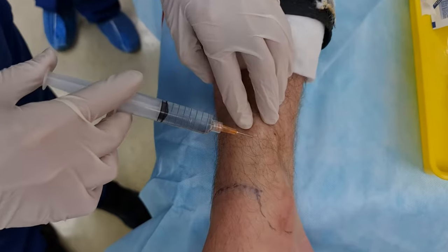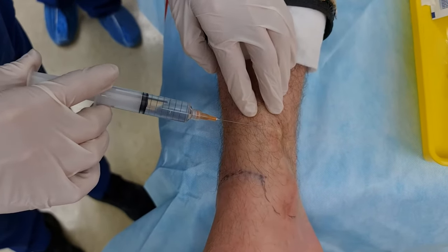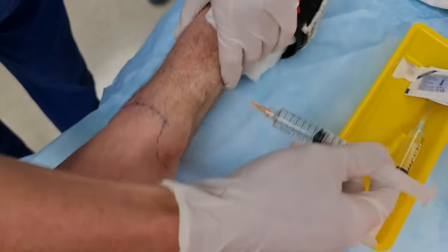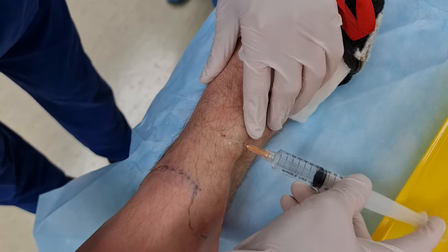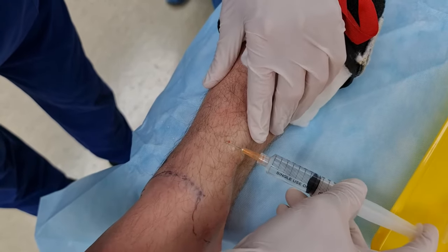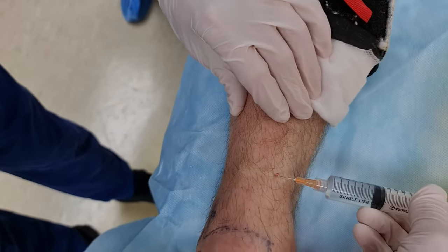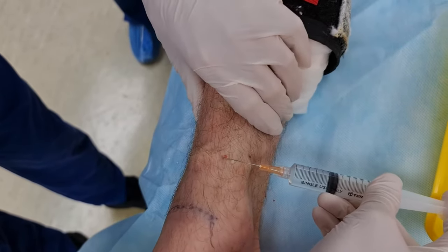You can see you'll draw up a bleb in the superficial layers of the skin. Then we're just going to work from the saphenous across to get your superficial peroneals as well. Same technique — you can see the slight superficial band there, so you're going to avoid that. Same caterpillar technique, and you'll see your bleb drawn up.